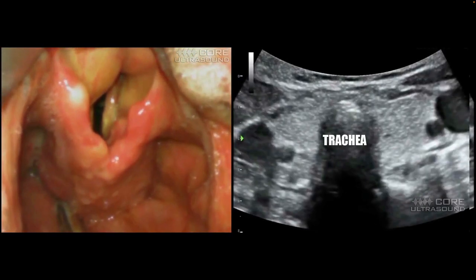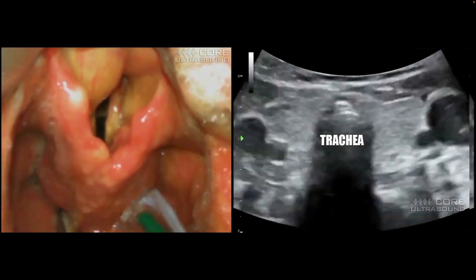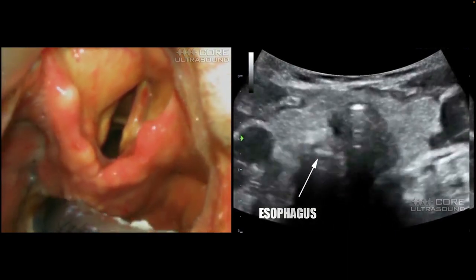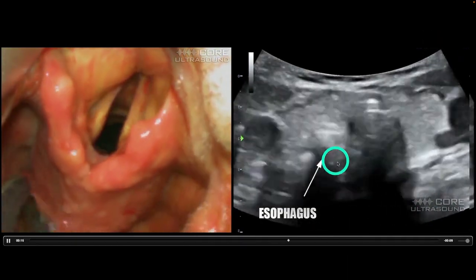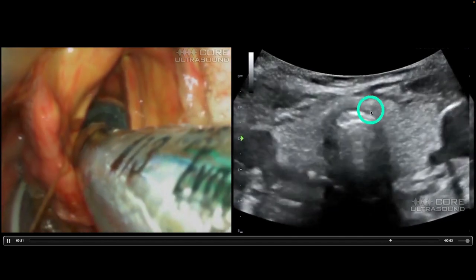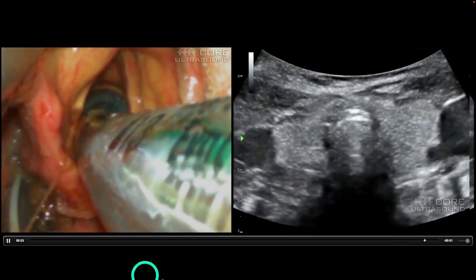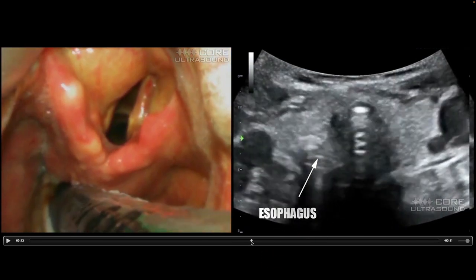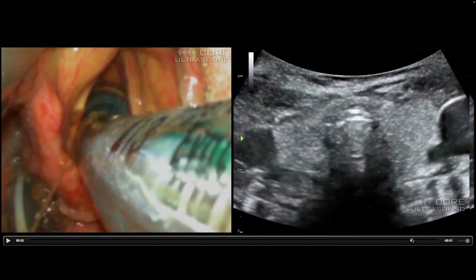This confirms a dynamic tracheal intubation - dynamic meaning you have the ultrasound in there as the procedure is taking place. This was a scenario where we had an early trainee using direct laryngoscopy while I was looking at video laryngoscopy and had somebody else look at the ultrasound. You can see down there a change in the esophagus - manipulation - which we don't want to see. And then when we redirect, we're able to see change in the trachea with no change in the esophagus. So this is a tracheal intubation - and right here we're seeing an esophageal intubation. This is bad. And this is good.